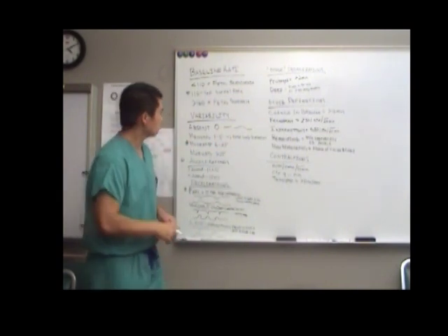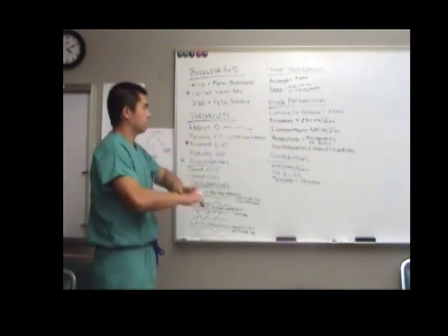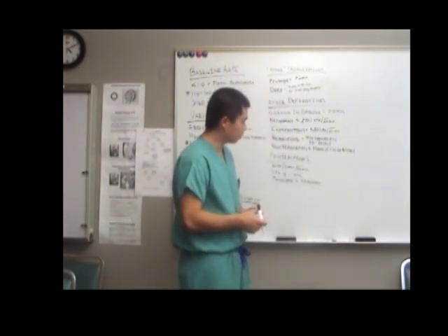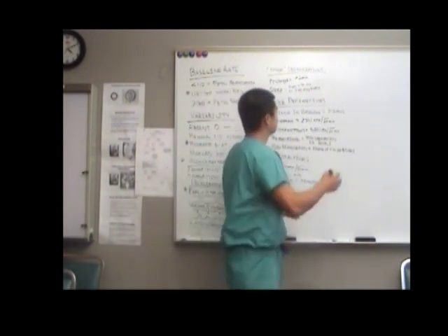So, taking all these things into consideration, they came up with guidelines for the category system. Okay, so there are 3 different types of categories.